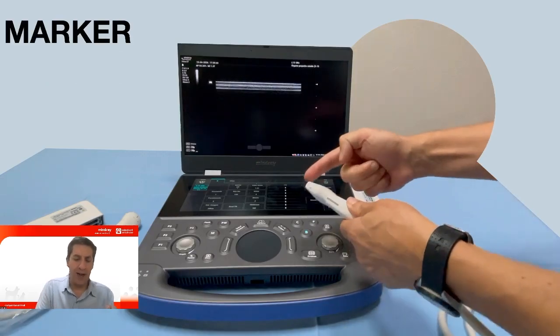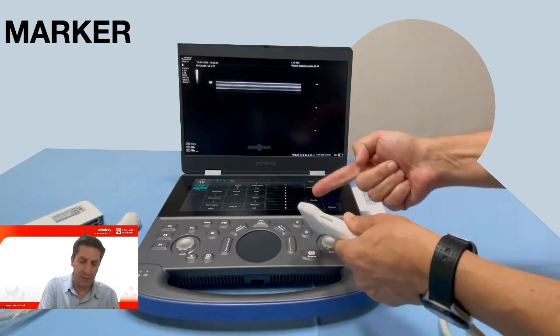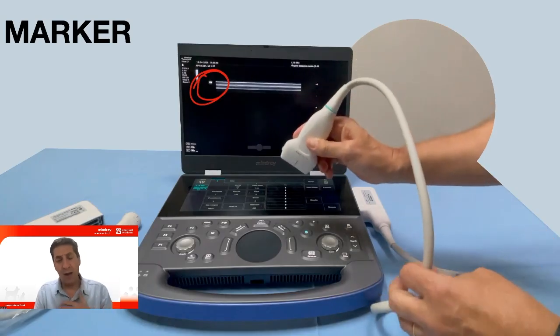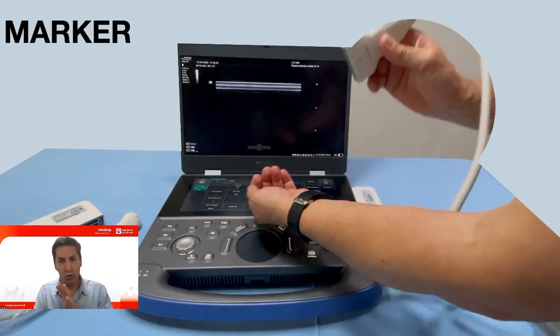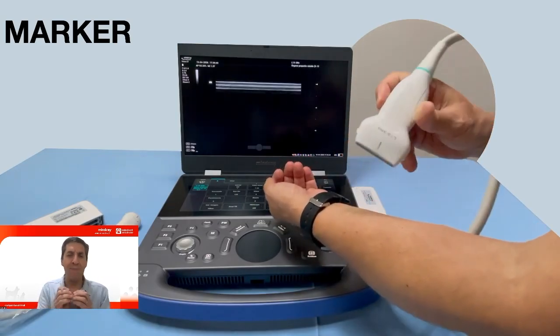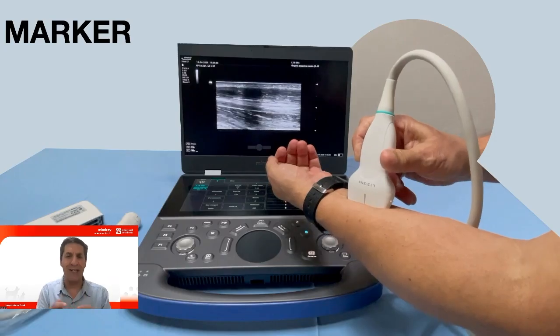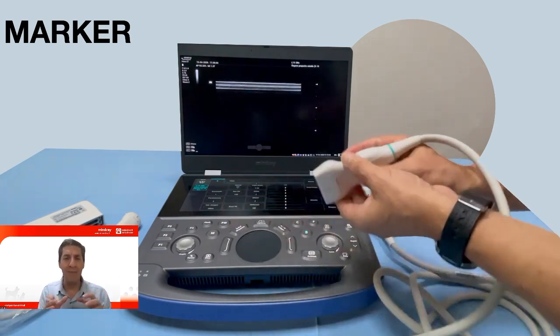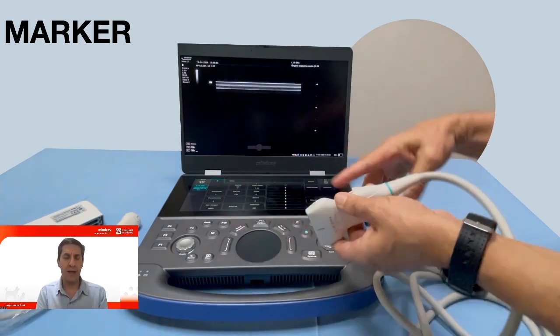And finally, the direction of the probe. This is, at least for us, super important, because if we always set the marker of the transducer in the same direction, we will always see the same image on the screen. When we put the probe on the tissue, we are going to have 4 cardinal points.